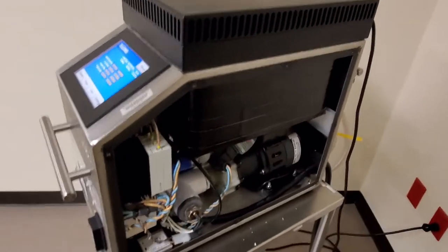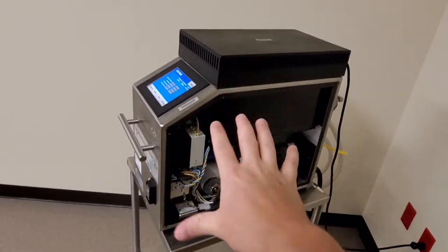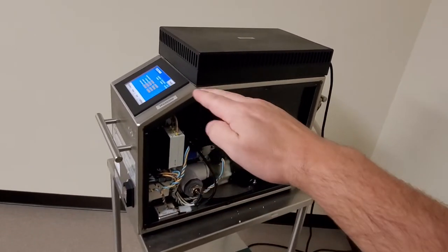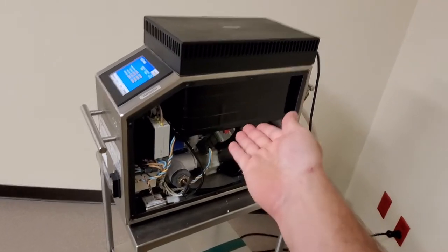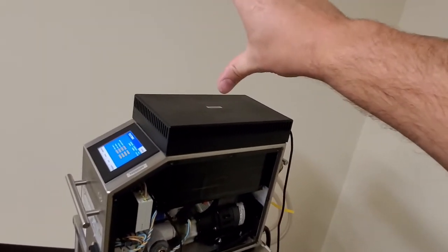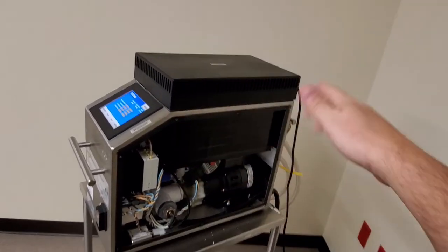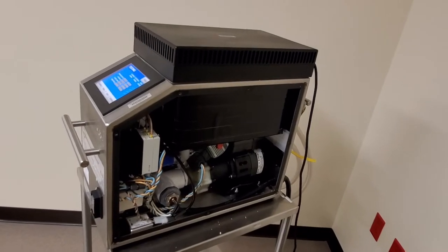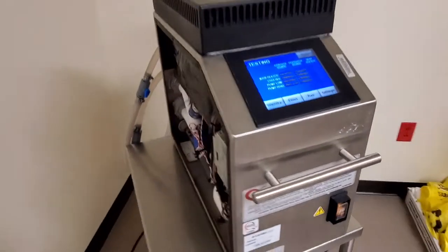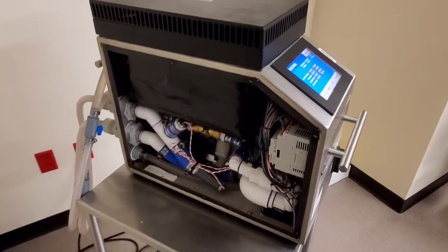But back to the heater cooler. There's three different variants of this. You'll see a CardioQuip like this with a Peltier cooler. There's the versions that just have a lid and they just use it as an ice bath. And then there's the versions that have a large contraption that sits on top, which is an actual compressor. So this version has got the Peltier cooler, and it's very plain Jane, very easy to understand. So let's take a look at what makes this guy tick.